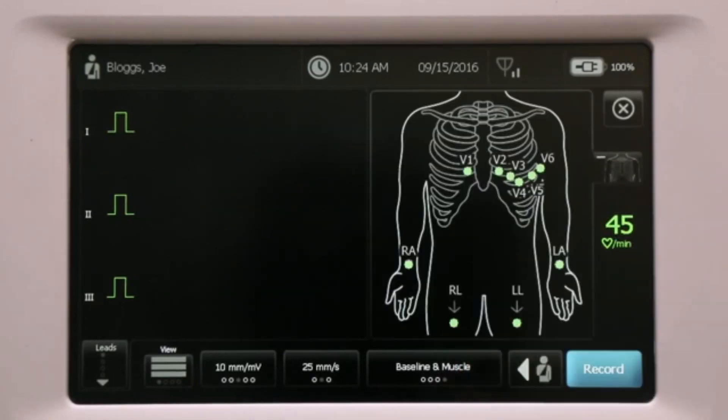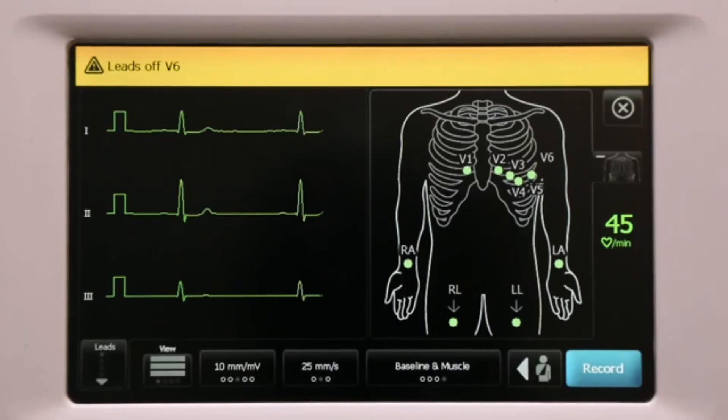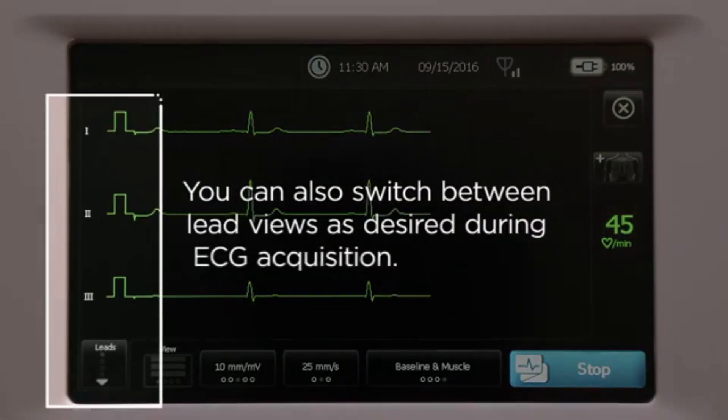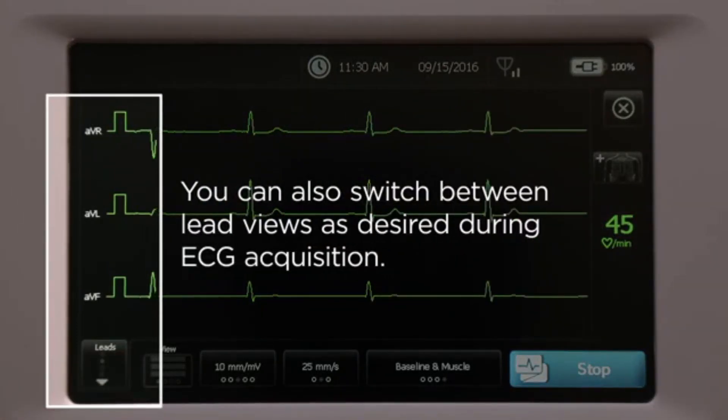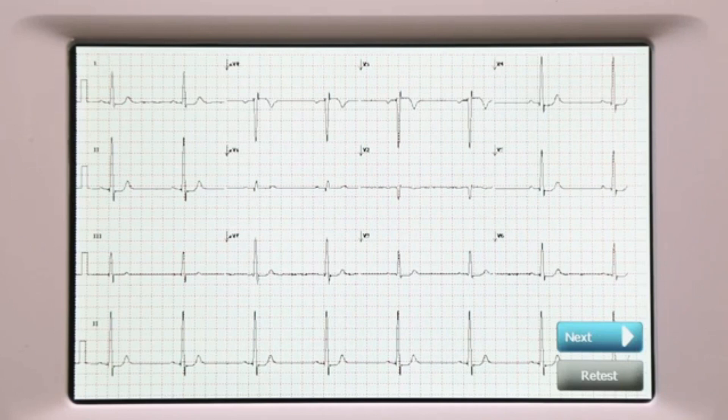Attach the leads to the patient. Please remember, the most common ECG problems are caused by poor electrode contact and loose leads. Any flashing dots on the ECG preview screen indicate unattached leads. You can also switch between lead views as desired during ECG acquisition.